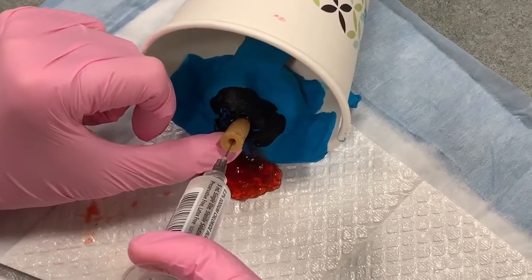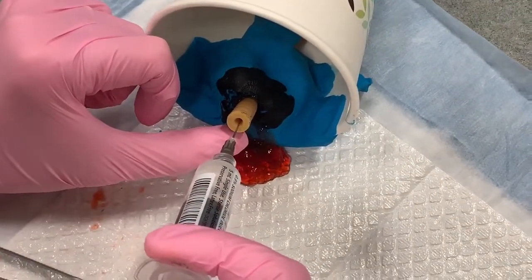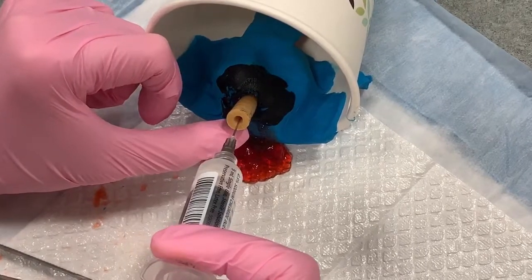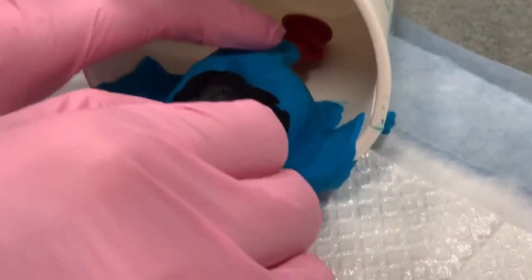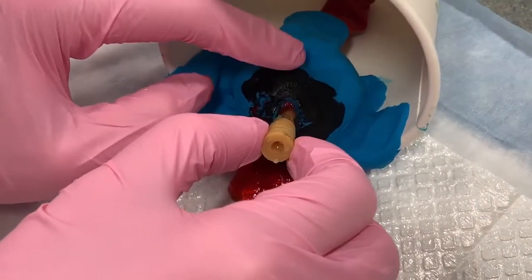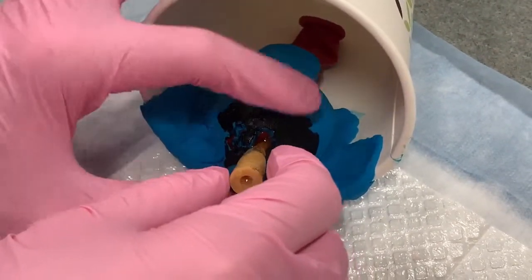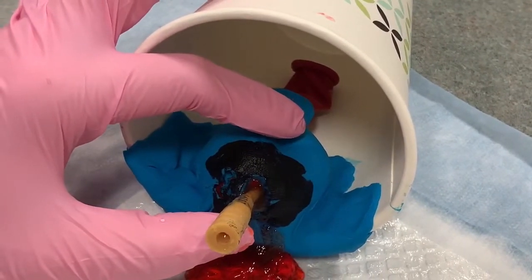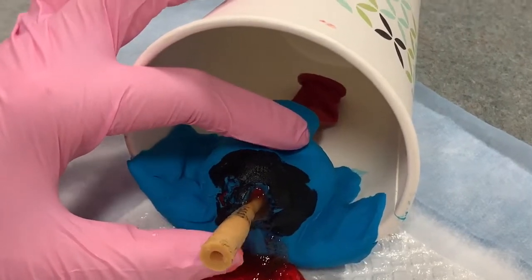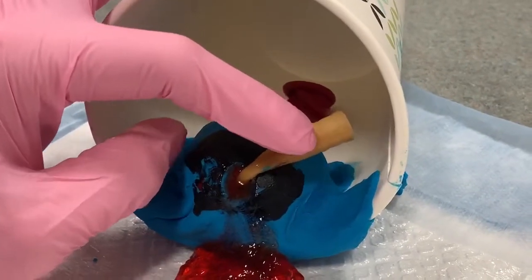My needle is in the middle of the catheter, and I'm going to inject it with saline to inflate the balloon. Now the catheter is in place. It has created another tract for the cyst to drain. We will then tuck the catheter into the vagina, and it usually sits there for 4 weeks, or it can fall out earlier.